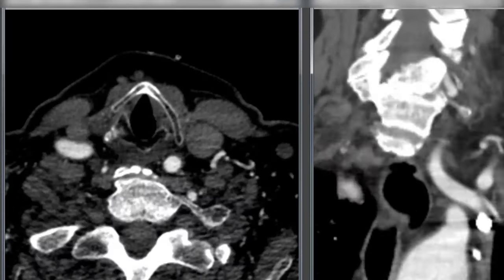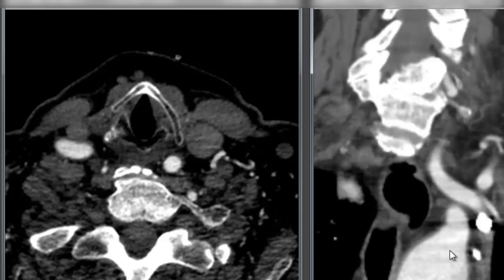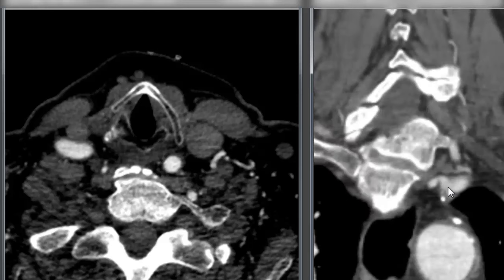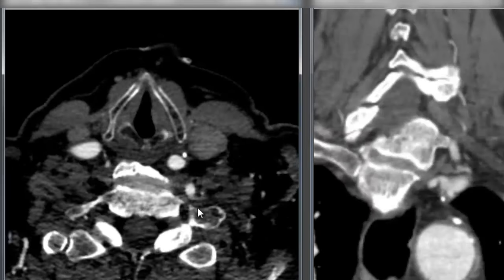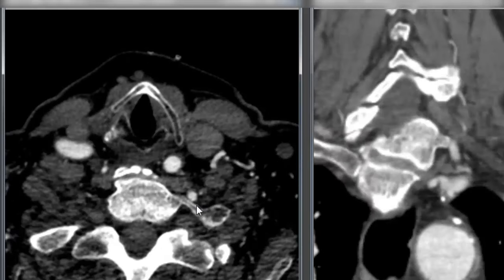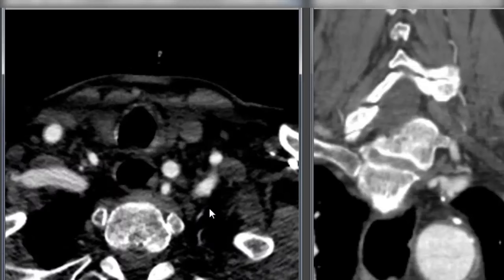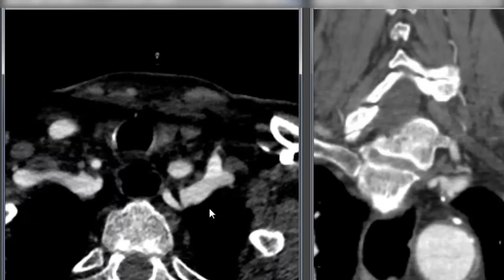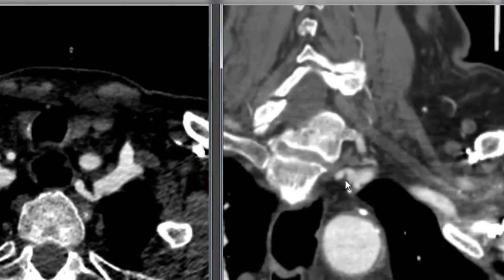Here we have our aortic arch, our subclavian artery coming up, and the origin of that vertebral artery with that same kink we identified. But it's not expected to be something that would make the artery impossible to select — it's just a sharp turn. Same thing we see in this reconstruction.